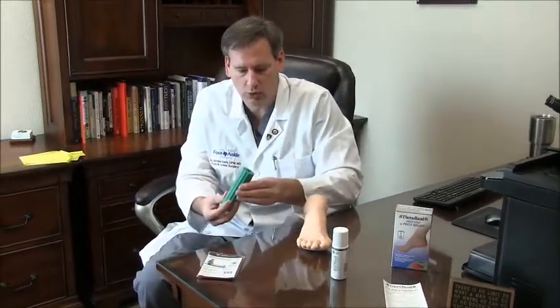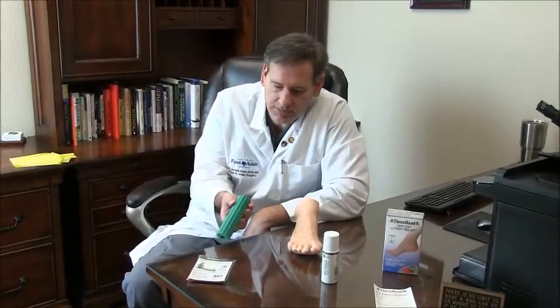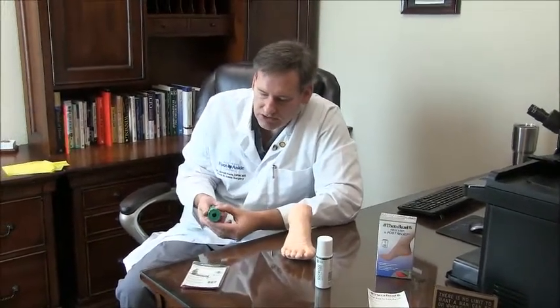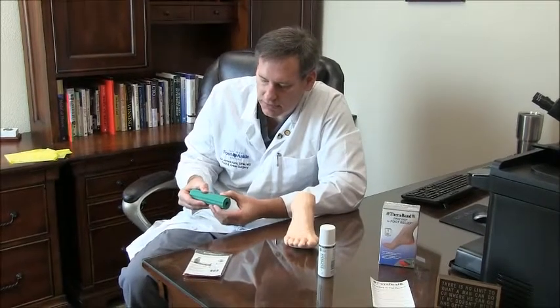It comes with a set of instructions. Also, it has a roller. You can actually put this in the freezer and get it completely ice cold. It's really better than a water bottle because it has these small little ridges that actually massage the plantar fascia as well as provide cold therapy.